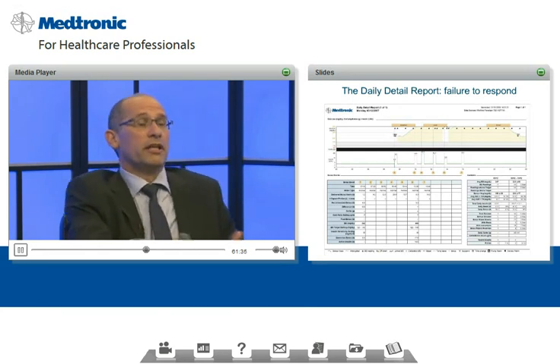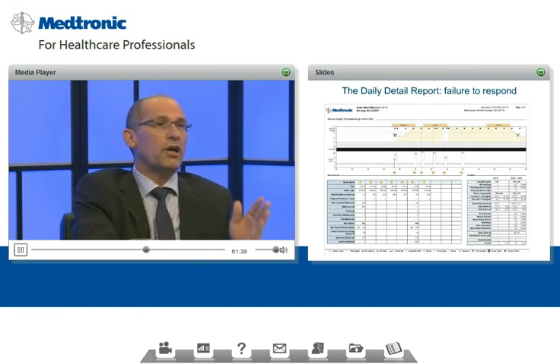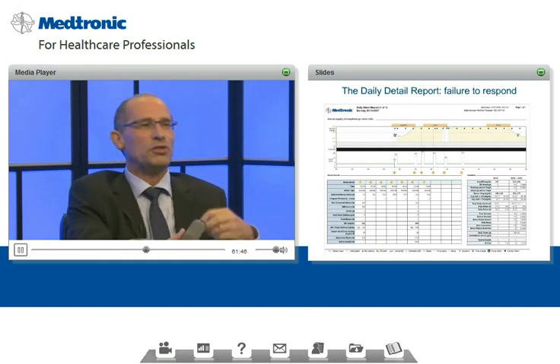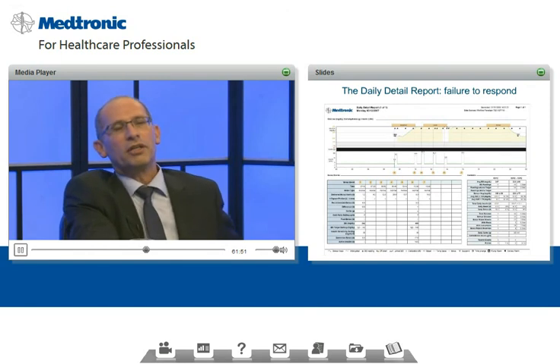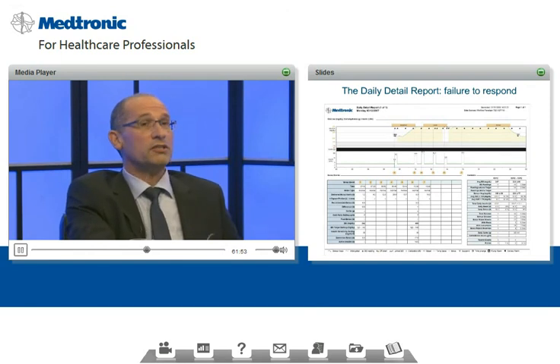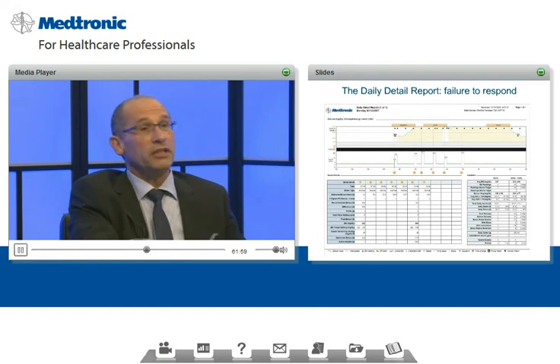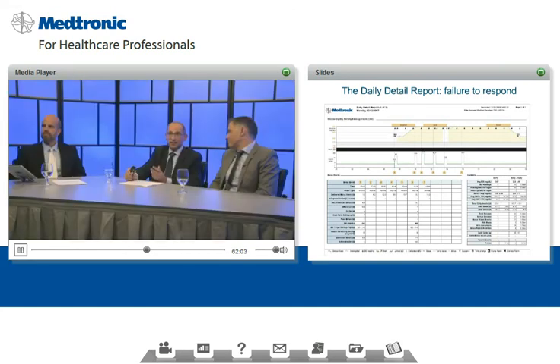seemingly that he knows he has all the technology, and he has sensors, and he's bolusing, but he didn't do the basic thing to do when you have 3 or 2 hours of high blood glucose, and that is do what is called the troubleshooting. Make sure that everything is connected right, you don't have air, you don't have bubbles, you don't have fluid running out of the catheter. He did not do that. He actually waited for more than 10 hours until he changed the settings. That tells you that even though he seems to be knowledgeable about using technology, in this case, he's not doing it intelligently, but you won't know it because we erased the name. Okay.